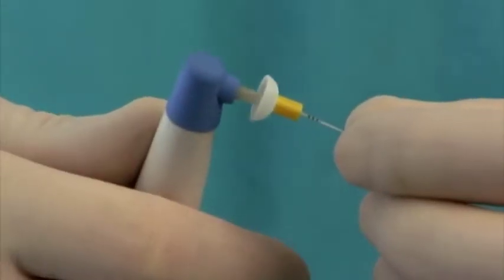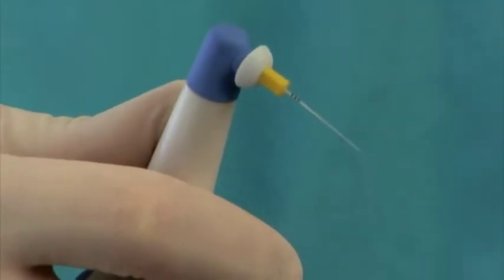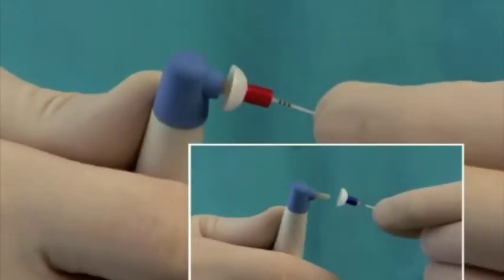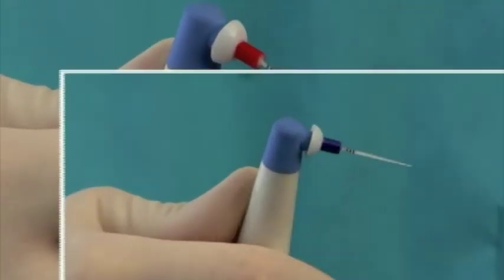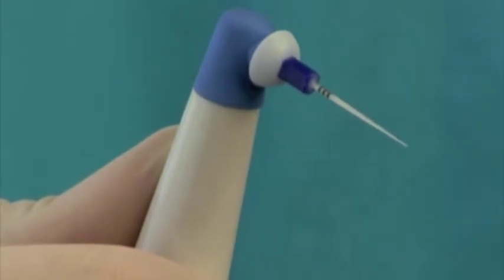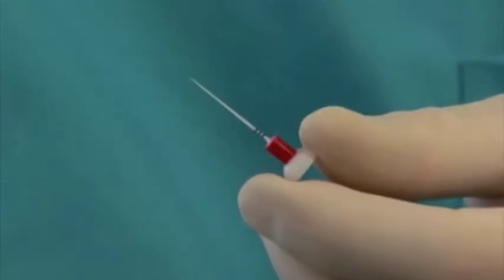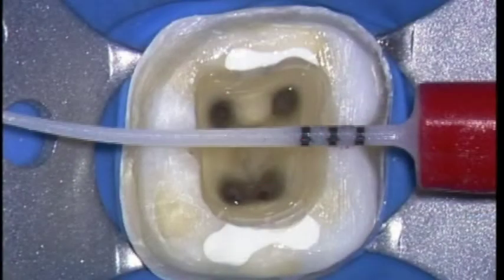The EndoActivator tips have an easy snap-on, snap-off design and are color-coded yellow, red, and blue corresponding to small, medium, and large sizes respectively. Importantly, the tips are made from a medical grade polymer, are strong and flexible, and are 22 millimeters long. The bowl-shaped clean guard serves to consolidate the protective barrier, and orientational depth gauge rings are positioned at 18, 19, and 20 millimeters.